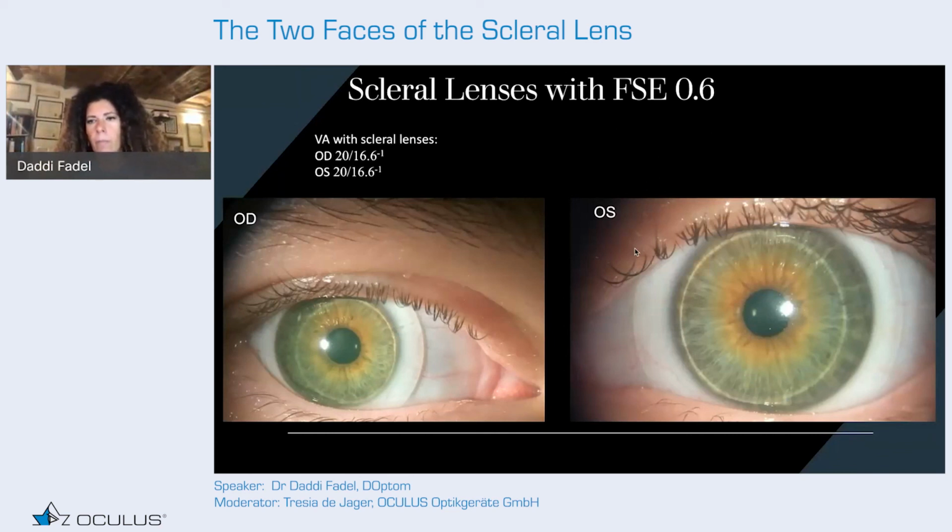Indeed. A question that was asked is, what would your suggestion or guidance be for someone who wants to start fitting scleral lenses? What's the process, or what would you advise them to start with? Okay, so if you want to start with what you have, start with the basic. With the basic level, you get maybe 2 diagnostic sets of different diameters. If you are still intimidated by large diameter, you can have a diagnostic set with a smaller diameter and start fitting with a smaller diameter.